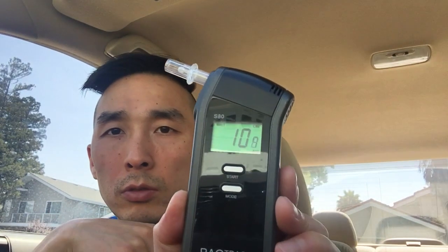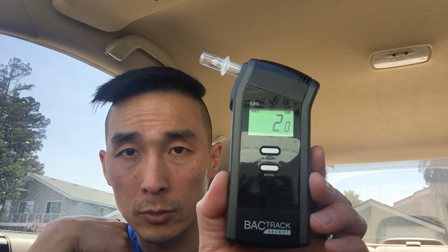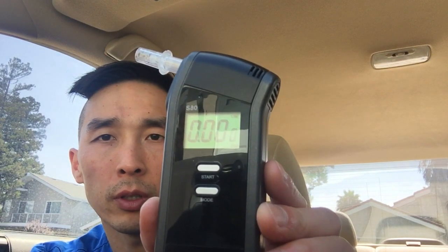What you do is just hit the start button. When you hit the start button it's going to have a timer and a countdown. Once that timer is done you just blow into it — you'll hear it beeping. It counts down: nine... down to five... okay, there you go. Beep beep — you heard that — and then it's reading.